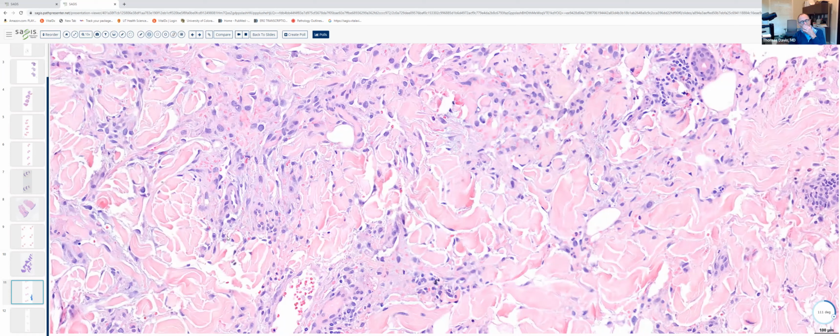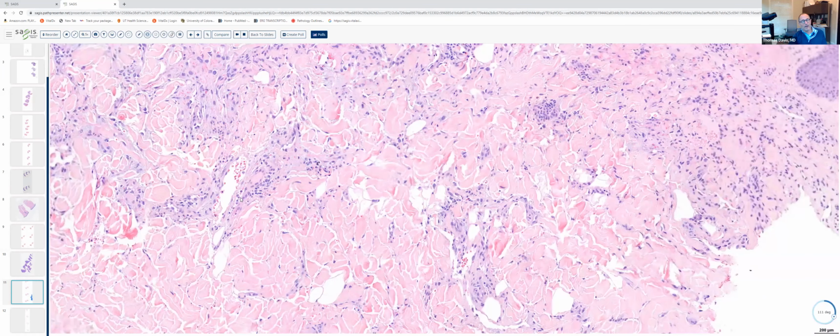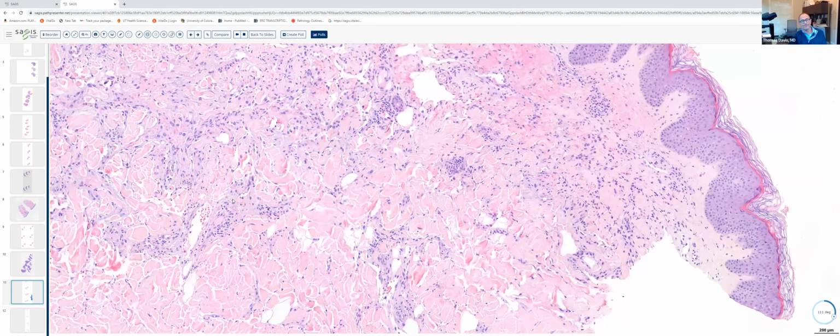But unlike the neovascular spaces that we see in Kaposi sarcoma, the endothelial cells here are a little more plump. And we don't have plasma cells within the infiltrate, and plasma cells within the infiltrate can be very useful in discriminating between this condition and Kaposi sarcoma. In this particular case, also the HHV8 stain was negative, which would be positive in Kaposi sarcoma.